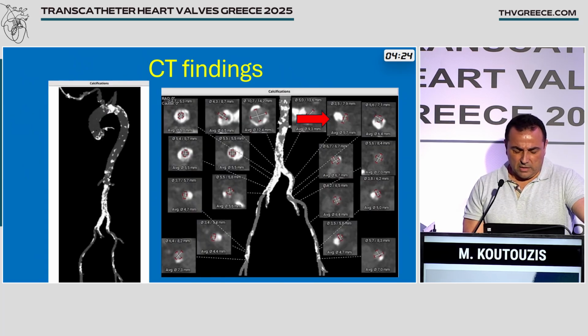You see here that it's very calcified, on the left and the right. Here is the stent in the right common iliac artery. It's very narrow, and we chose to go from the other leg because we didn't want to mess with the stent. Here you see that there is a big nodule of calcium. So that's why we chose not to proceed with balloons or shockwave and go to orbital atherectomy, in order to crack this calcium and debulk it also.